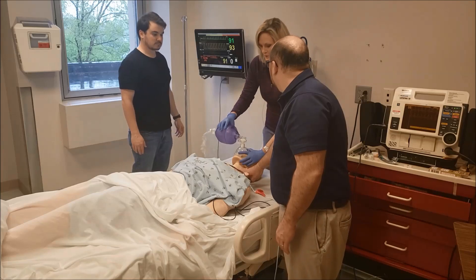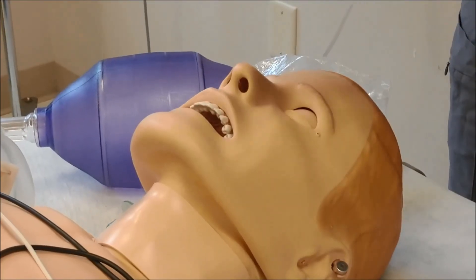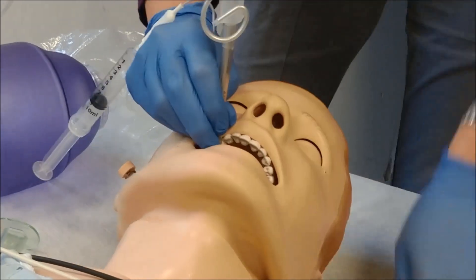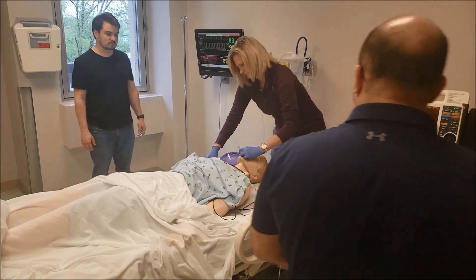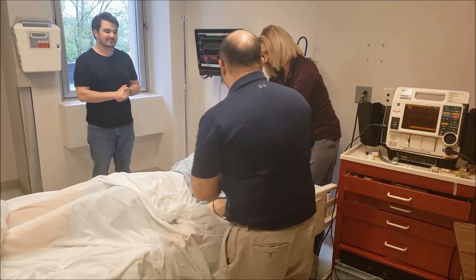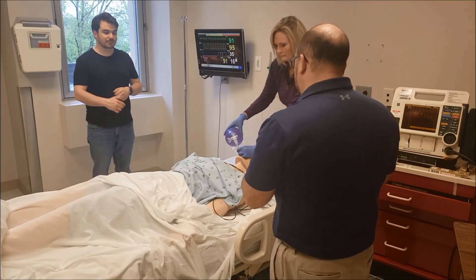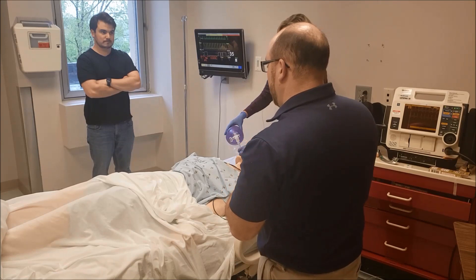Is he ventilating on his own? No. Okay, we'll need to intubate this patient. We need to get a set of vital signs. We'll confirm ET tube placement with waveform capnography, chest x-ray, and bilateral breath sounds. Blood pressure is 91 over 54, heart rate 91, saturation 94% and slowly increasing. Bilateral chest rise confirmed. We're going to order an EKG, a full set of labs including cardiac markers, and keep running our fluids.